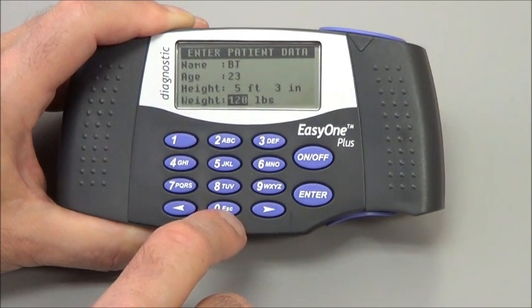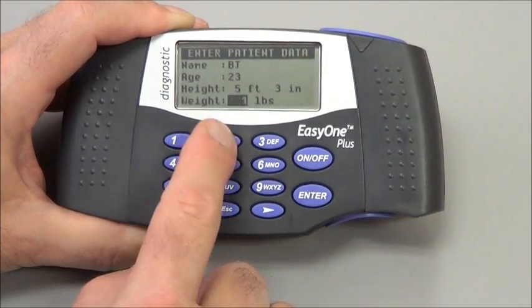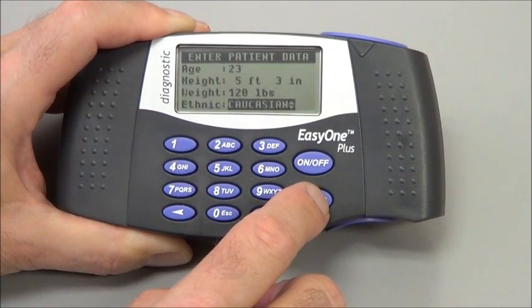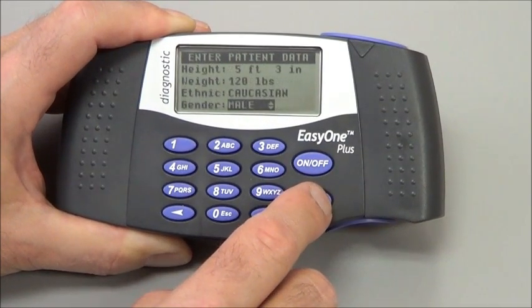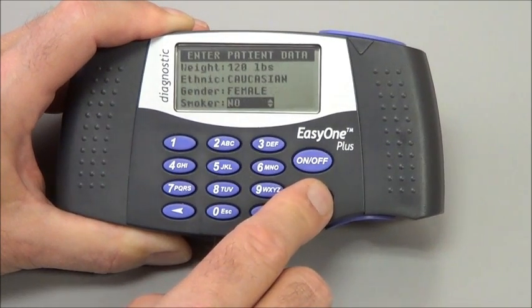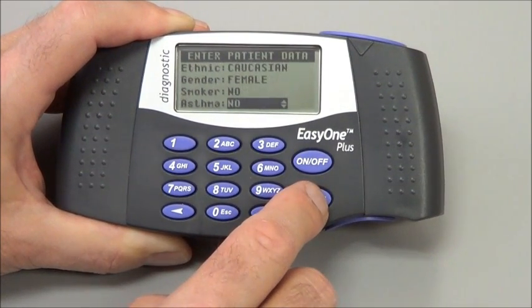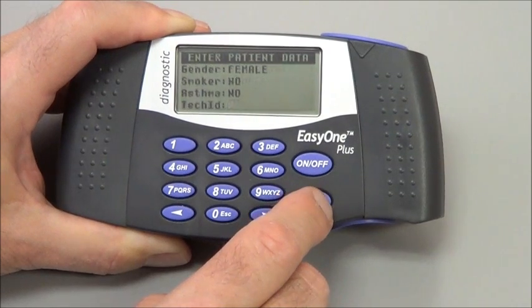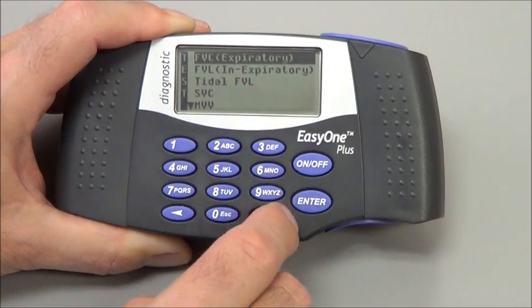That will take me back to the previous field where I can re-enter the correct information and keep going. Next are the patient's ethnicity, gender, whether they're a smoker or not, and whether they have asthma or not. Once you're done with that, it takes you to the test menu.